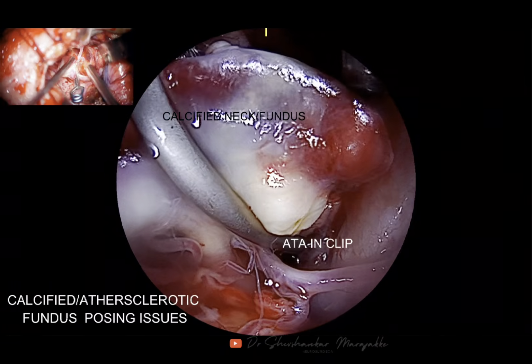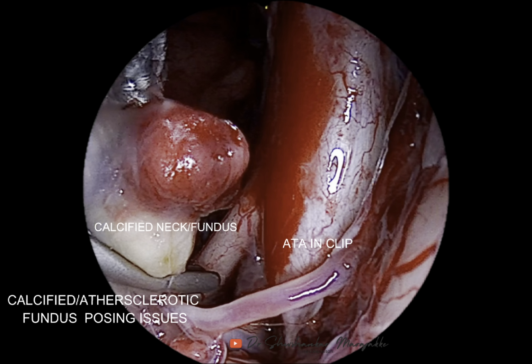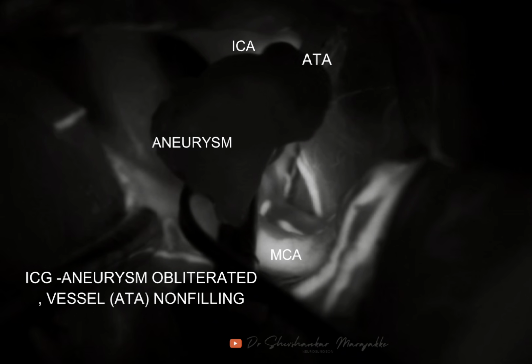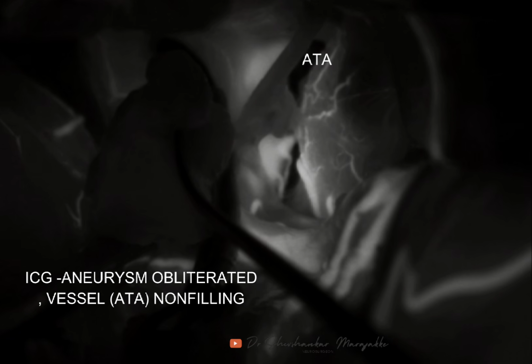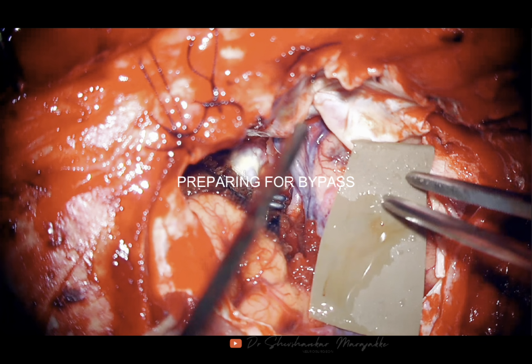So you can see that I initially felt that there is some part of the vessel which is patent, so probably it is filling. But once I used ICG, you can see that the aneurysm is completely obliterated. The ICA, M1, M2 are seen, but the antetemporal artery is completely, the ATA, you can see it is not filling. It is completely obliterated. It's a quite big vessel. So for this reason, the only solution I had was end-to-end anastomosis. So in this case, what we did was I divided the antetemporal artery.